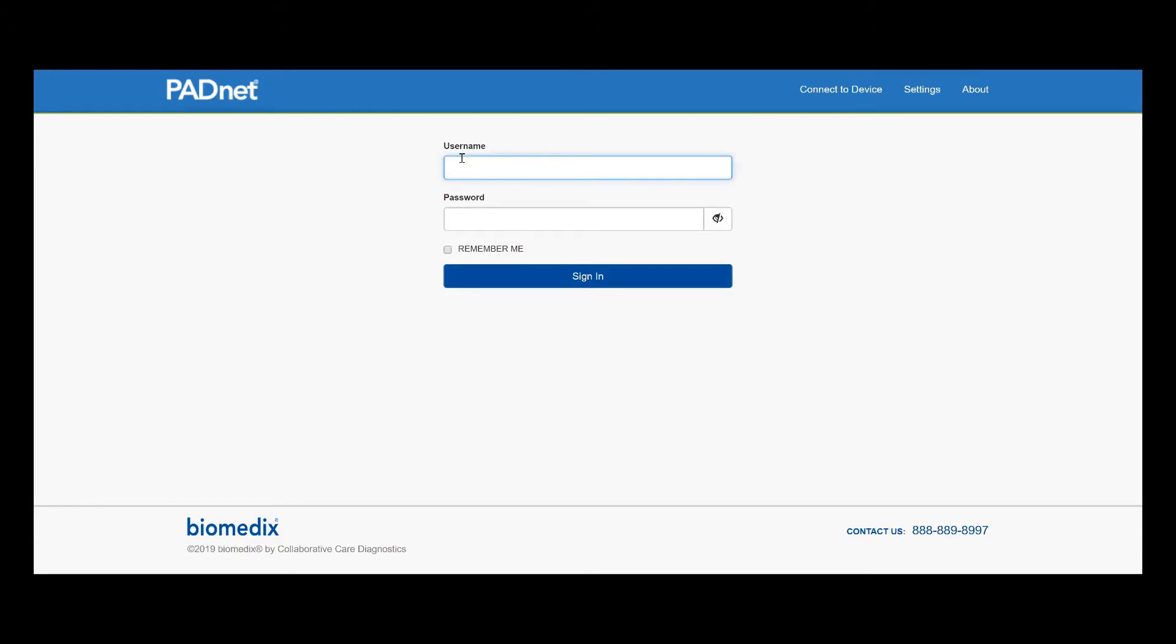We can go ahead and move to our testing website and log in with the same credentials as before.